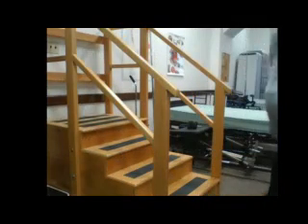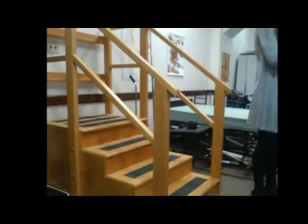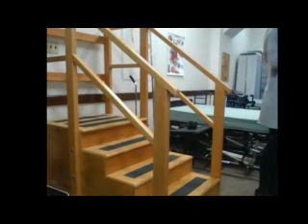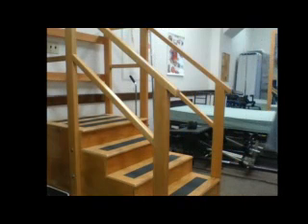Alright, so when we're doing gait training on the stairs, we have to take into account where we need to be positioned as well as what the patient should do with the assistive device, and it's going to vary slightly depending on the assistive device. So if I'm walking with my patient and she has the cane in her left hand, I'm to assume that her right leg is her weak leg, so I'm going to stand on the right side. So go ahead and walk up to the step there.